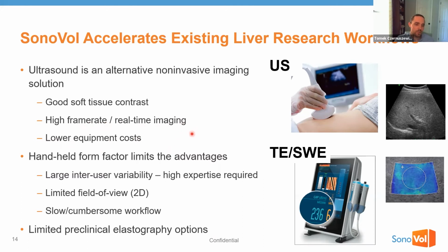But the big drawback with ultrasound, and one of the challenges, particularly preclinically, is the handheld form factor. What that means is that because it's handheld, we now have a limited 2D field of view, and we need an expert sonographer to place this probe in the right spot every single time. Otherwise, we incur inter-user variability.